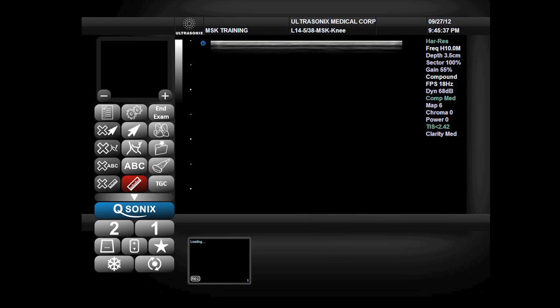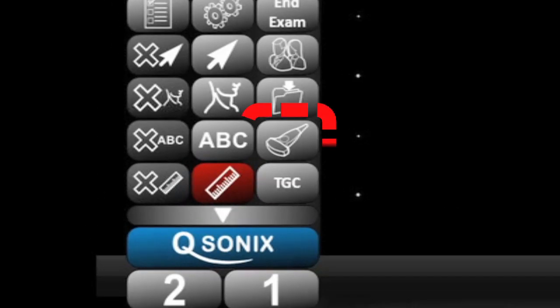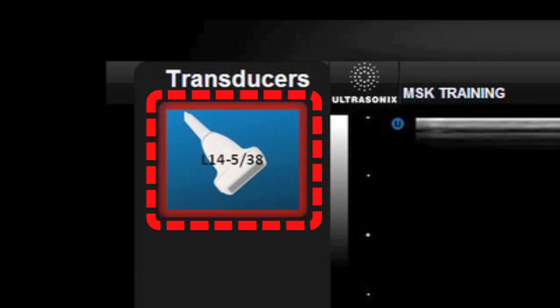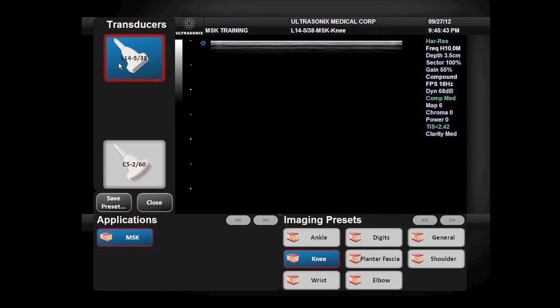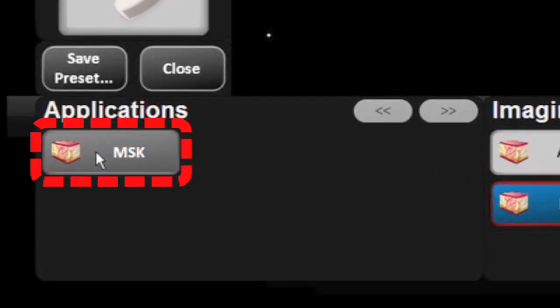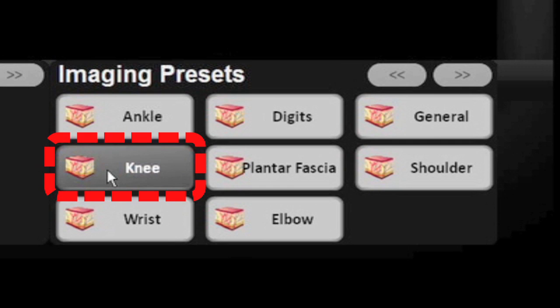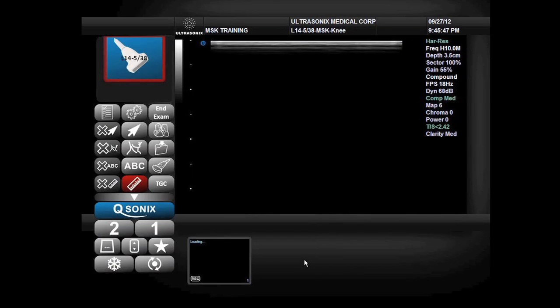To select the appropriate presets for the knee examination, we will select the high-frequency linear 14-5 probe, the musculoskeletal application, and the knee preset.